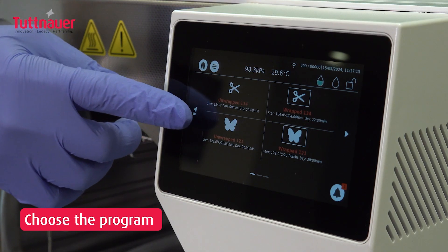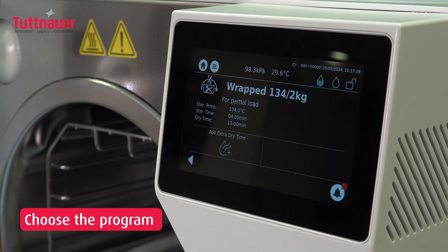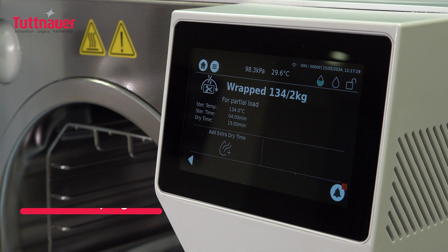It is imperative to select a program that not only meets your immediate needs but also aligns with the tool manufacturer's guidelines for sterilization. Use the partial load program for smaller loads to save time.